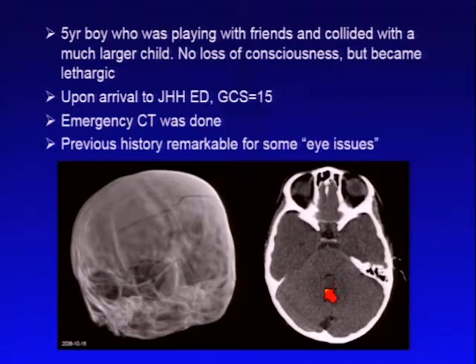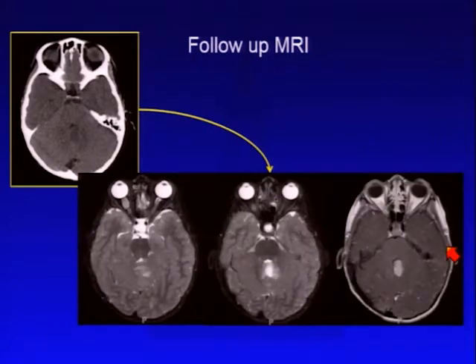And he described there was a focal hypodensity dorsally to the fourth ventricle, and he said we should do some follow-up MR imaging. I think I would have missed it, honestly. Now, MR was done. And there is indeed a focal T2 hyperintense, somewhat ill-defined, minimal mass effect, contrast-enhancing lesion sitting over here. Okay, so he was right. And apparently these eye issues helped him a little bit.